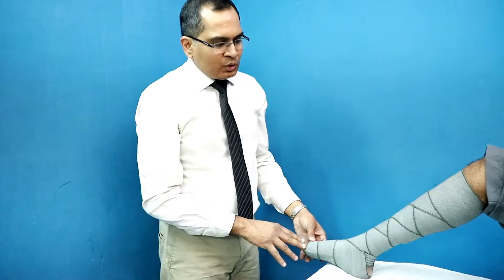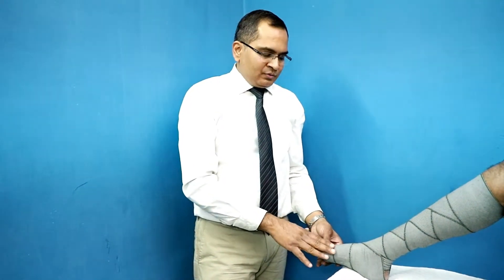We also need to check the ankle brachial index of the patient. For patients having ankle brachial index between 0.5 to 0.8, we need to be careful and apply lesser compression. And for patients having ankle brachial index less than 0.5, compression bandaging is not advisable.